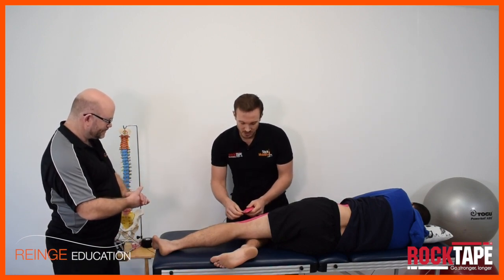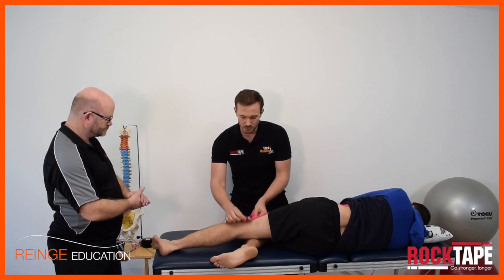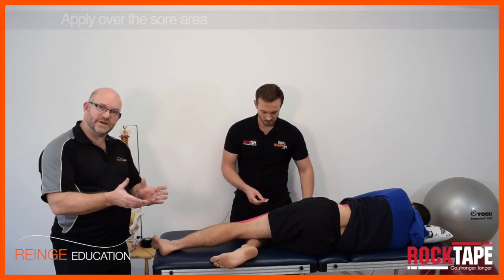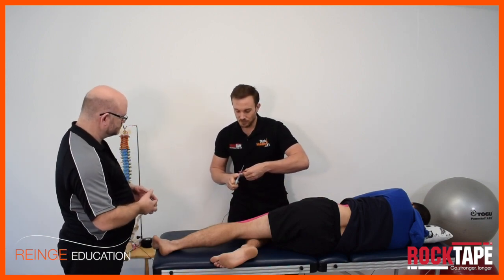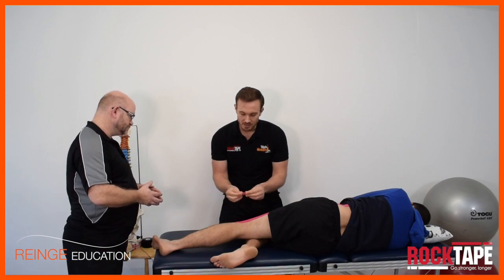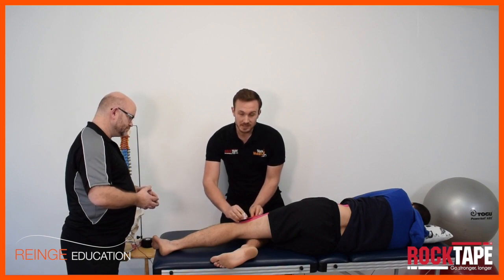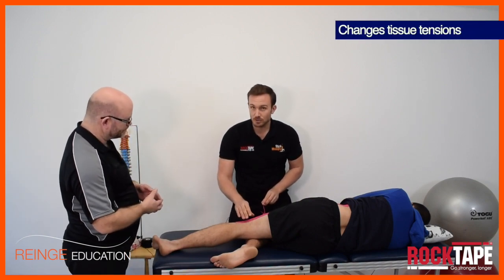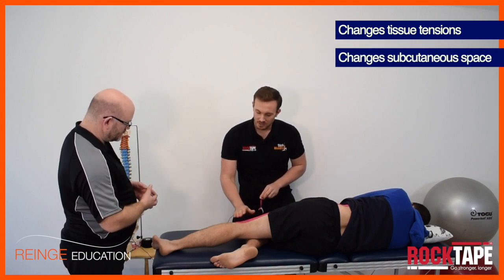Absolutely — if there's an area of specific pain you can take a decompression strip and apply that over the sore area. If this is the first video you've watched, can you quickly explain what that decompression strip is actually doing physiologically? There are a few theories about the mechanisms by which the tape works. The reason it's called decompression is that you take the elasticity of the tape, place it over a sore area, and that can help make changes to the underlying tissue tension, which can also make changes to the subcutaneous space.